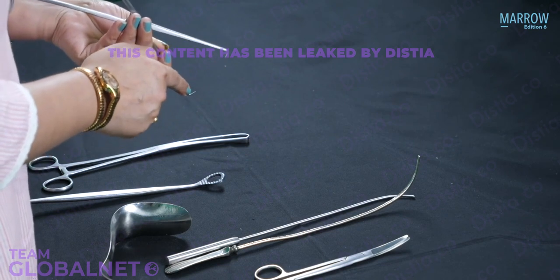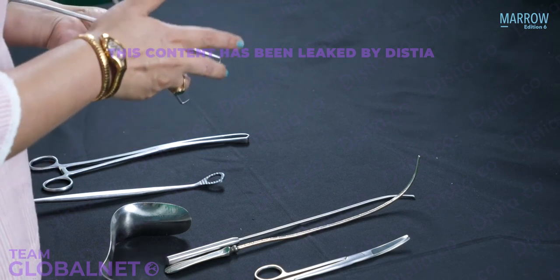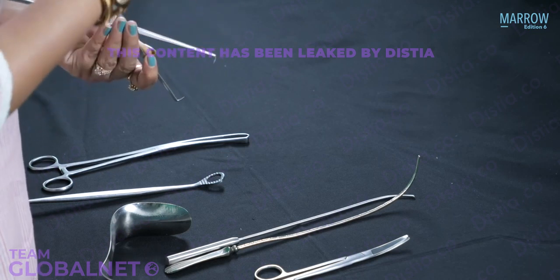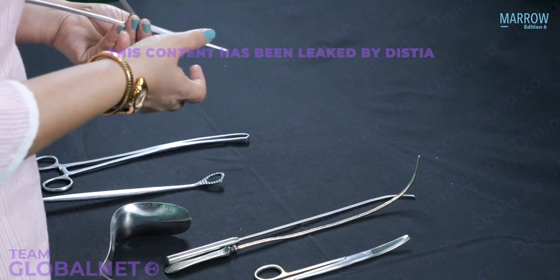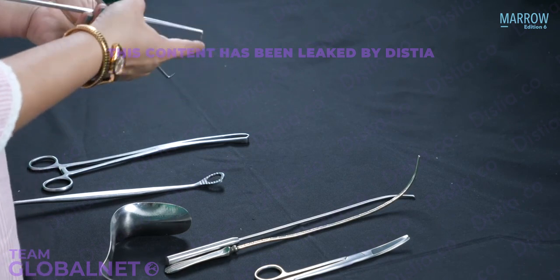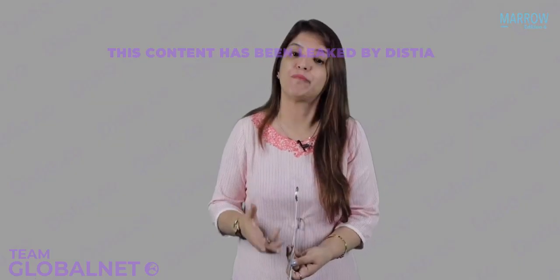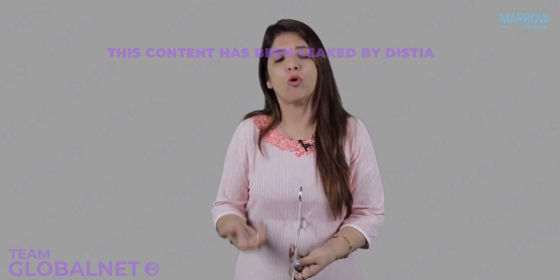So either you can use a tenaculum or you can use a vulsellum. Anything can be used to hold the anterior lip of the cervix while you are inserting copper T. The only advantage of using vulsellum is that bleeding will be a little less in comparison to this sharp tooth tenaculum. As far as post-procedural pain is concerned, it's almost same whether you use a tenaculum or a vulsellum, right?